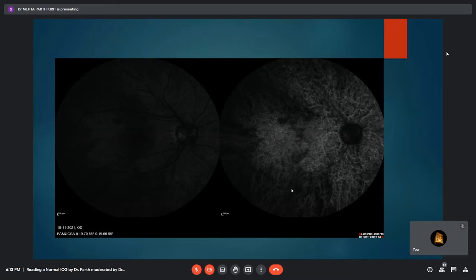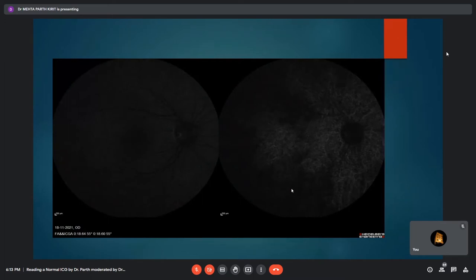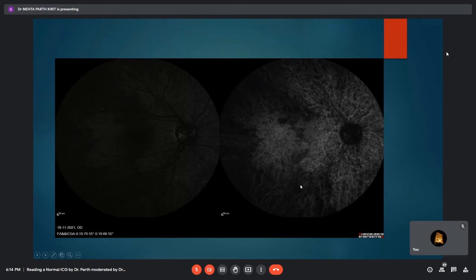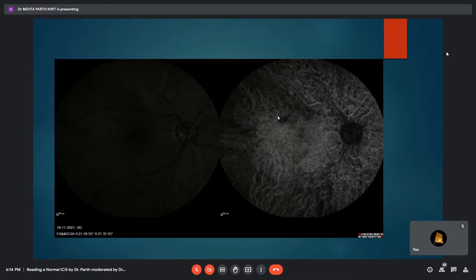The moderator asks why the watershed zone blurs out in later phases of ICG angiography. A fellow responds, noting the order of choroidal filling: first the outermost Haller's layer, then Sattler's layer, then choriocapillaries. The question of why blurring occurs is posed to the group.